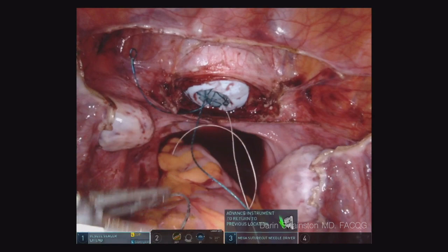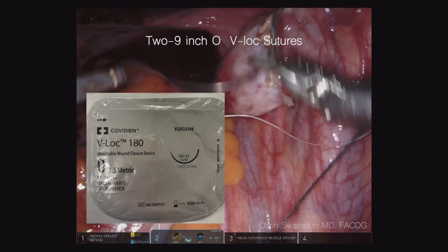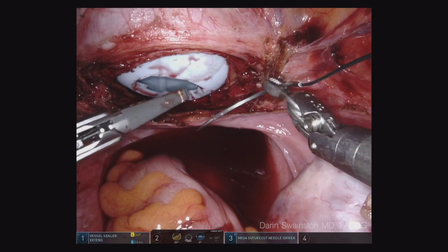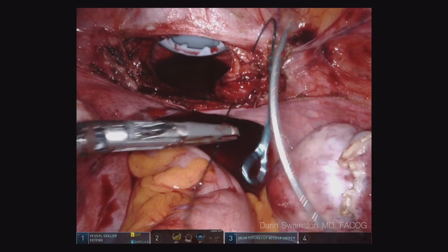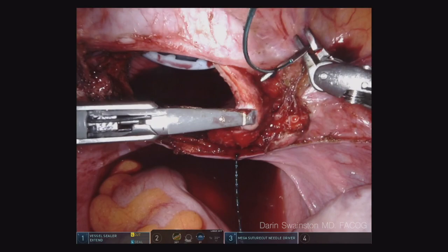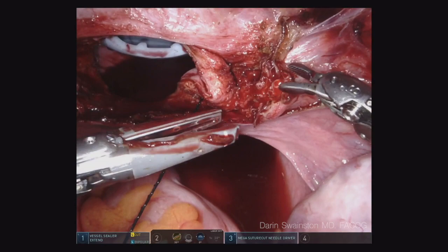I do use two V-lock sutures — they're 9 inches long, CT1 needle, and they are 0-gauge, 180-day. I recently switched over to this because when somebody has a prolapse and you need better support, I want a longer lasting suture that's larger. When you look at the model of general surgeons, they do not close fascia with anything lower than an O suture, so I want to use an O suture to close the fascia on this. I know this is a vaginal mucosa closure — I guess you could use a 2-0 on the vaginal mucosa.